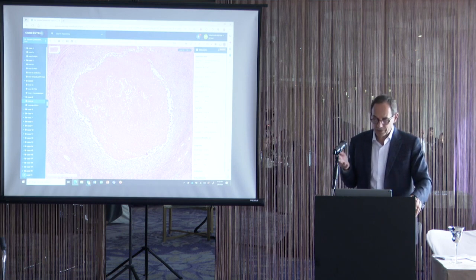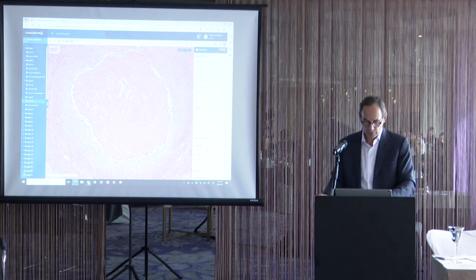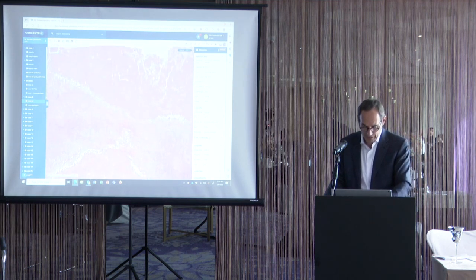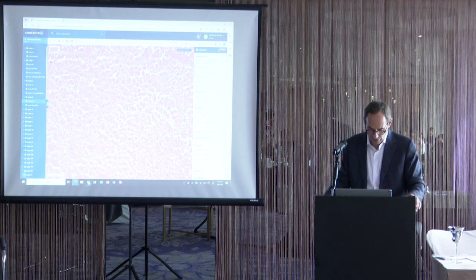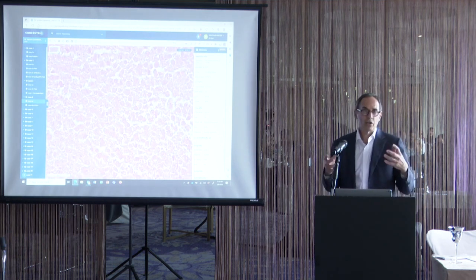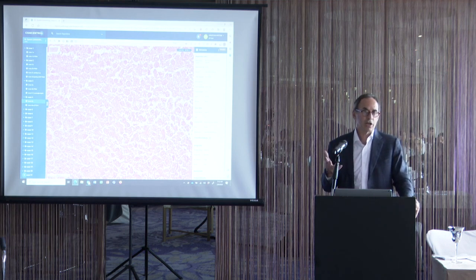Is it infectious, tuberculosis? Is it an infarct in the testes, which you can see due to vasculitis or trauma? Or is it necrotic tumor? And so let's look at it a little bit at higher magnification. And what you can see when you look at it at higher magnification is that this is cellular necrosis. We can make ghosts of cells in there. When we use the term cellular necrosis, basically we're saying it looks like necrotic tumor.